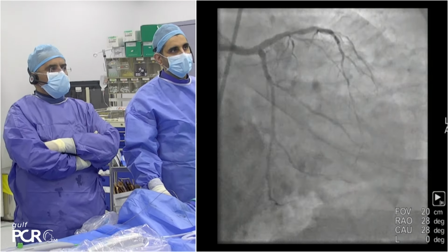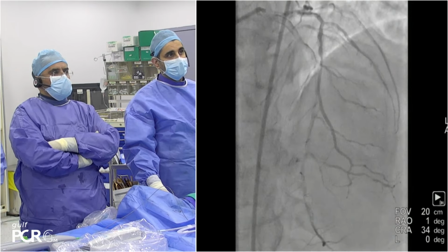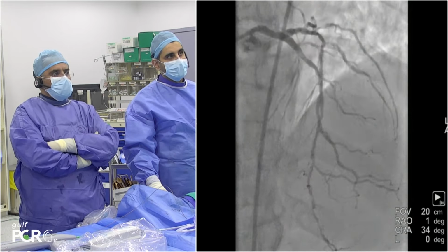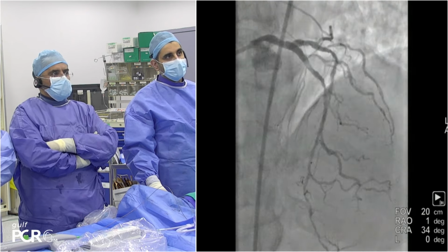Next picture. This is an AP cranial picture showing our LAD, which is diffusely diseased, with some haziness in the proximal segment at the takeoff of the diagonal and the septal, which we found out later has a calcified nodule by OCT.